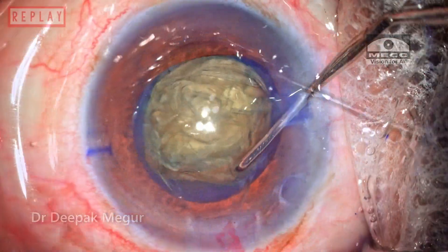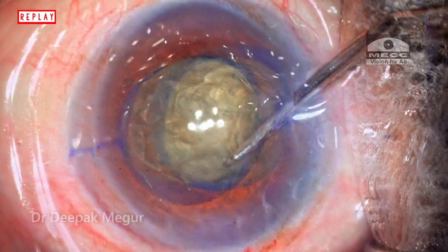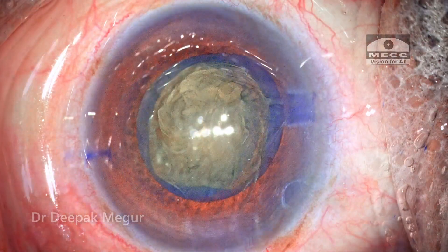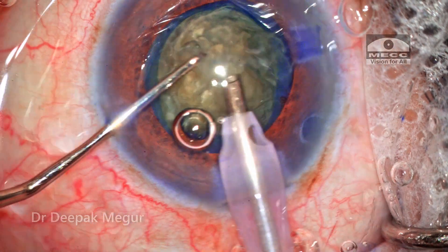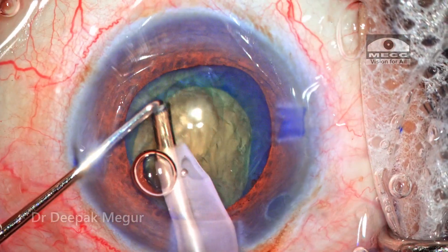This confirms that the cortical attachment to the capsular bag has totally broken, and we can proceed with the nucleus emulsification process. Because the zonular weakness is not very pronounced, I am postponing the insertion of the CTR at this stage. If the zonular weakness were severe, I would have definitely considered inserting the CTR at this stage itself.